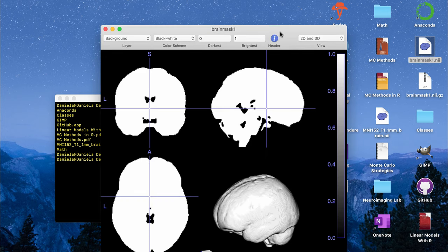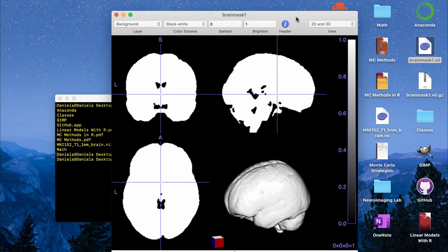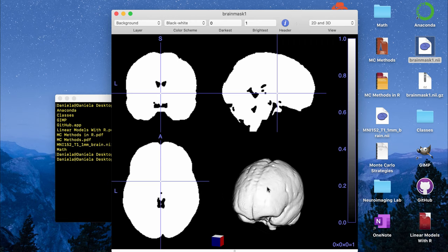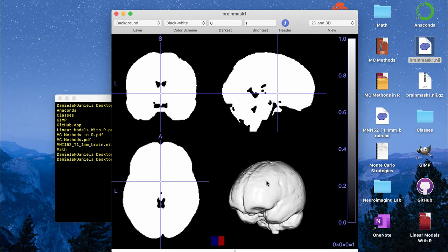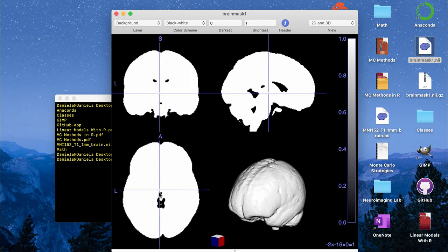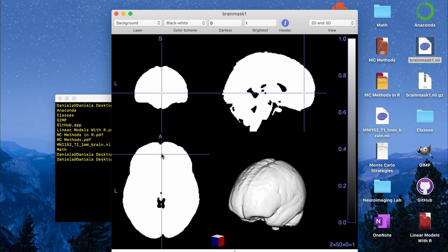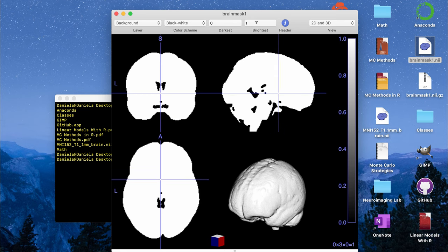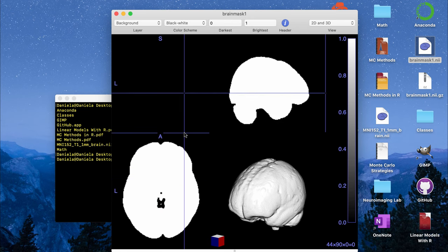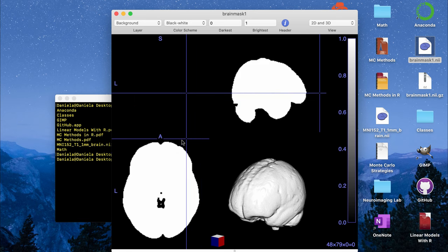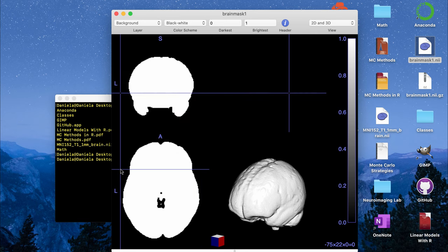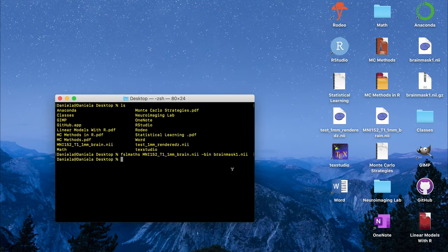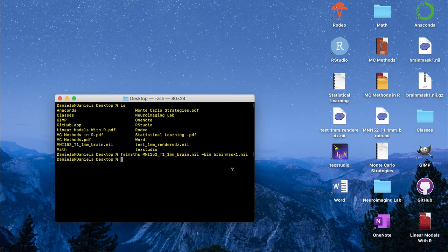Now when I double click the nifty file to open it, this is in a different viewer but you can see that now instead of having it look like different shades of gray, the values are either 0 or 1 and the 1 value is given to everything that's brain and the 0 value is given to everything outside of the brain. That's the method you would use to create a whole brain binary mask, and in the next example I want to do creating a binary mask for a region of interest.